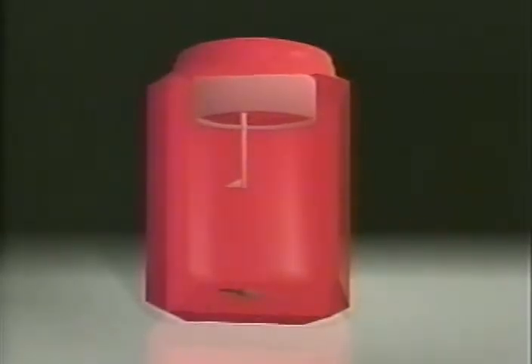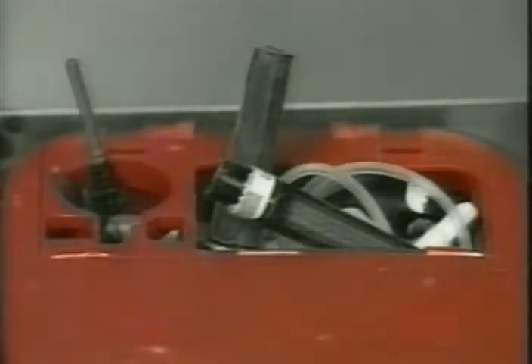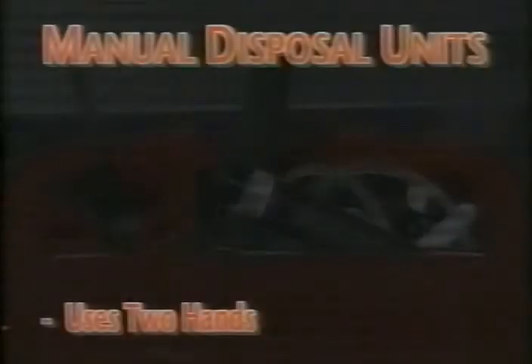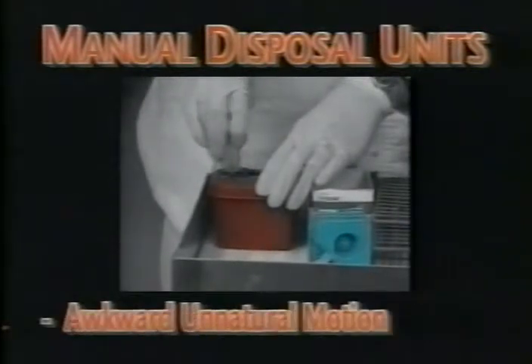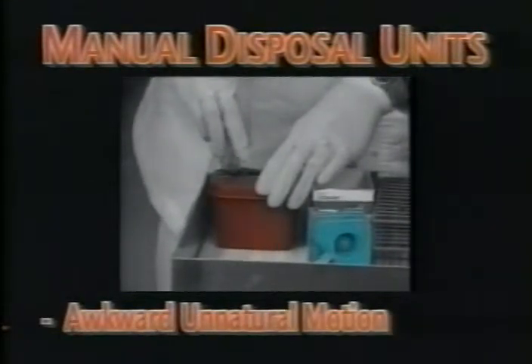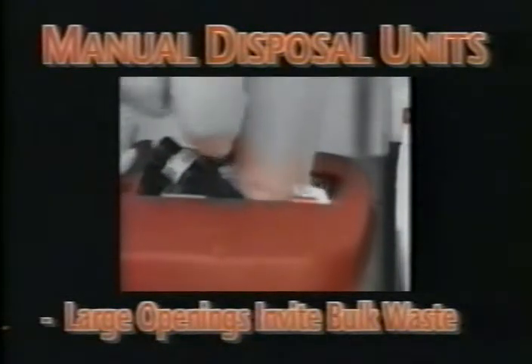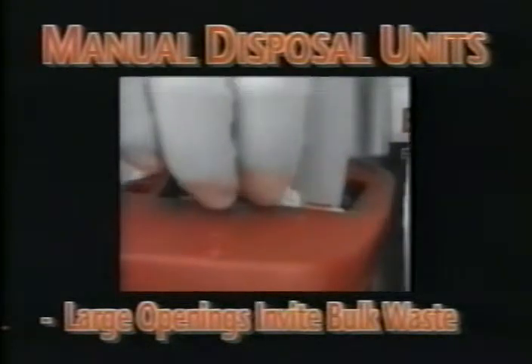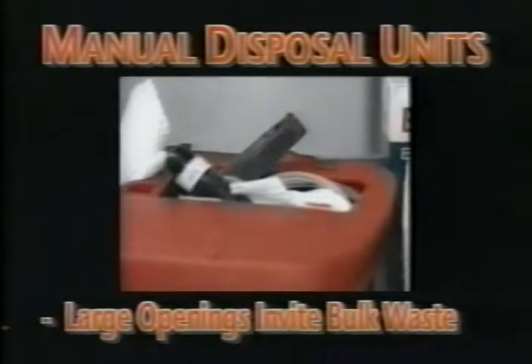These methods complicate a simple disposal procedure, forcing the phlebotomist to use an open plastic container with needle removal slots cut into the top. These manual methods cause several problems. The outdated manual method requires the use of two hands, performing an awkward, unnatural motion. Additionally, the large openings in these containers invite the disposal of bulk waste materials like cotton, gauze, and needle caps. All too often, this foreign material hides upturned needles, resulting in accidental needle sticks.